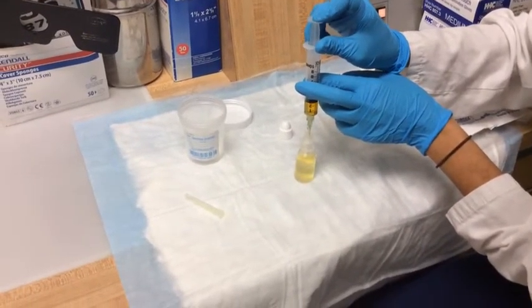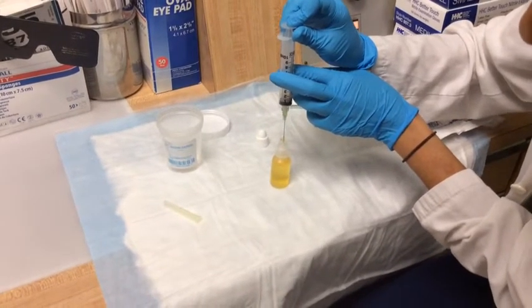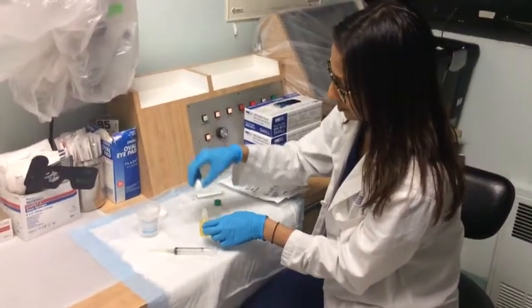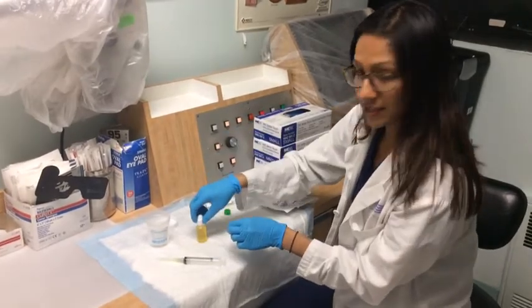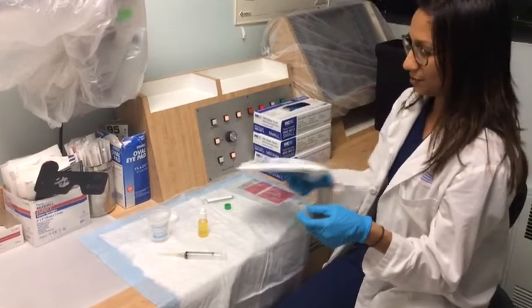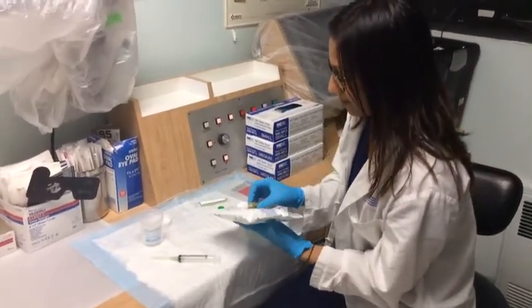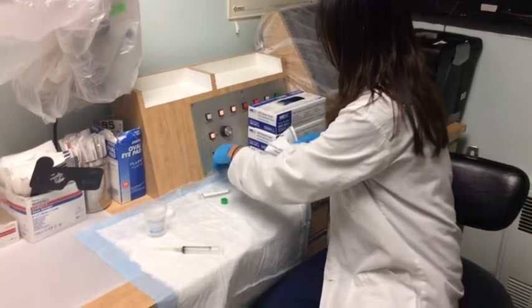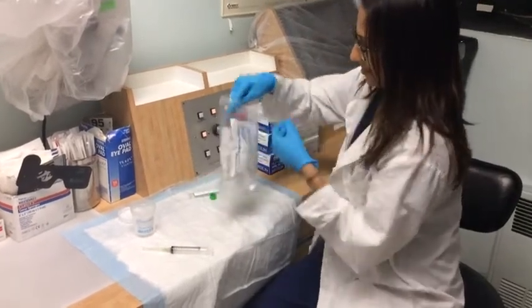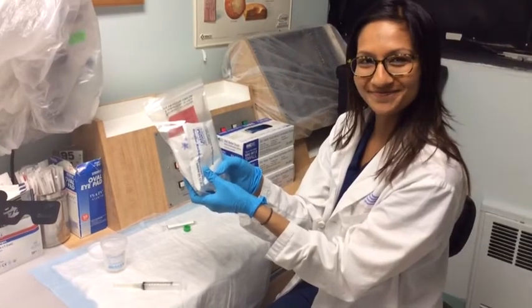The BSS bottles are actually made larger than 15 ml, so they can hold more than 15 ml. Even though we're making a total of 16 ml of fluid, if the patient is storing this in the freezer, there should be plenty of room for expansion so that the bottle doesn't burst. We want to keep this on ice, so we're ready with our ice pack — we'll burst the inside and create a convenient cold pouch for our patients to take home. We'll wrap that up nicely and put it in a bag. That should keep for about an hour or so of traveling time, and the patient can keep it in the fridge or put it in the freezer when they get home. Thanks so much.